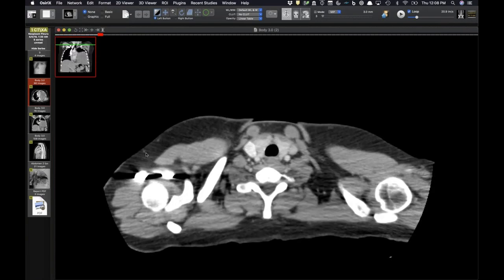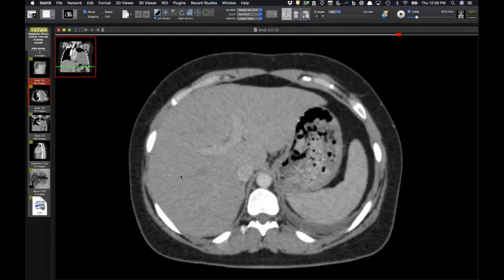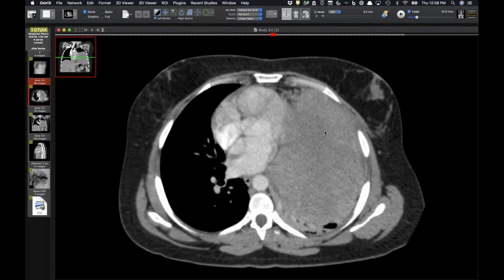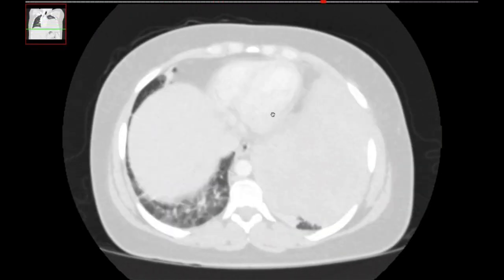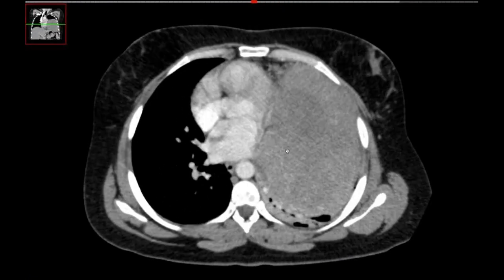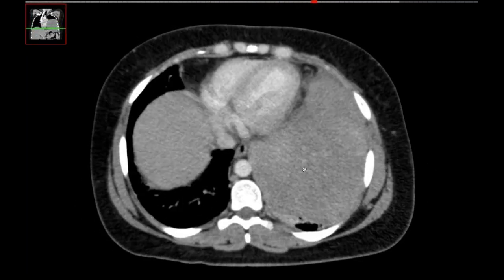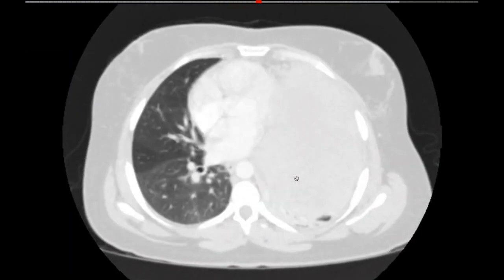This is a patient who is 28 years old and has this humongous mass in the left hemithorax. And this mass is so big that it's hard to tell where it's coming from. It looks like it's probably pleural or maybe mediastinal, or coming up from the diaphragm or somewhere. But certainly with large masses, you think about sarcomas, especially in young patients, or some big germ cell tumor. She's only 29. Any guesses on what you think this is? Because it's actually something we see, just not usually in patients this young. And I know that's probably a leading question. Is it a big giant thymoma?